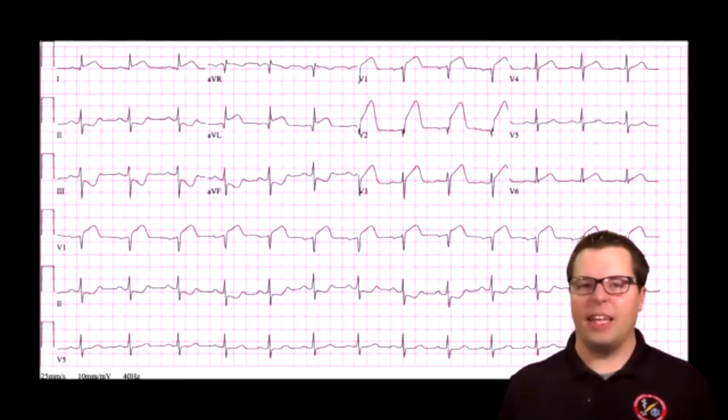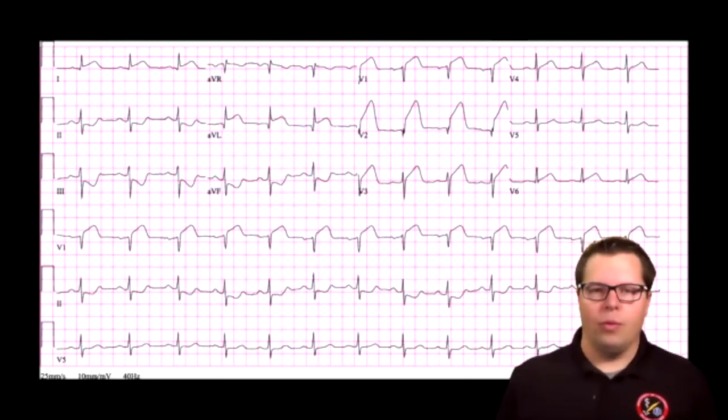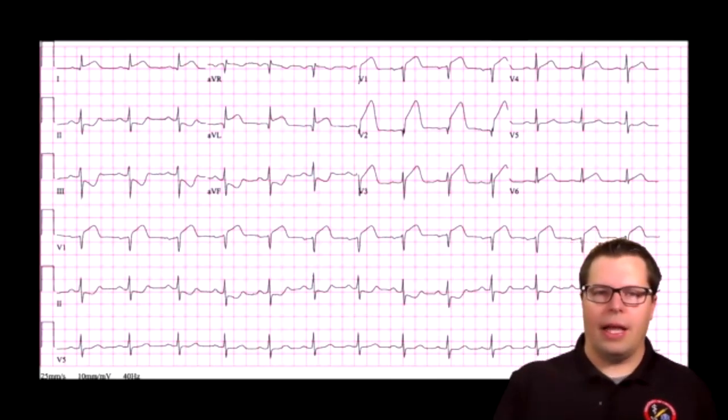Rate, rhythm, axis, intervals, ischemia, infarcts. What are we looking at infarct-wise? You're looking again at the ST segment, and you're looking for ST elevation. There are a couple of different ways that ST elevation can look. This is the classic one.